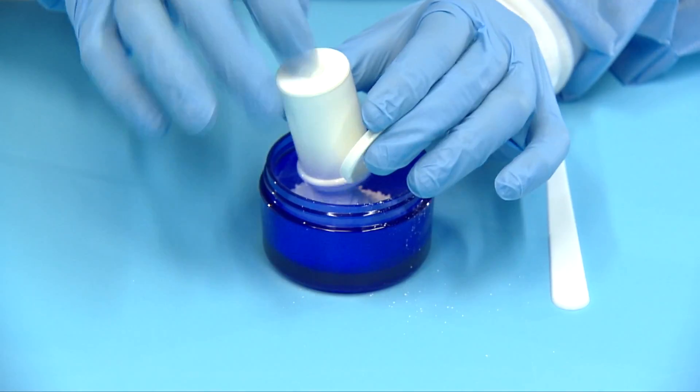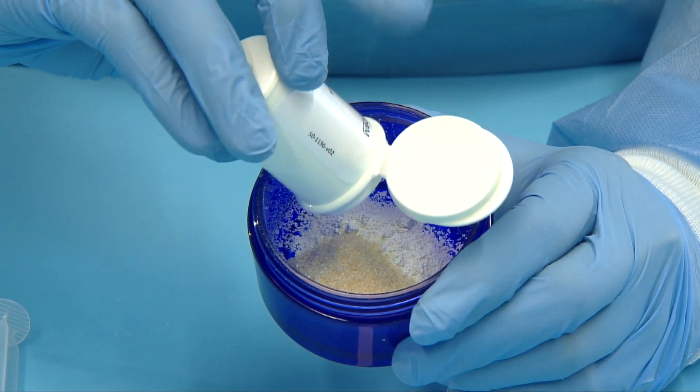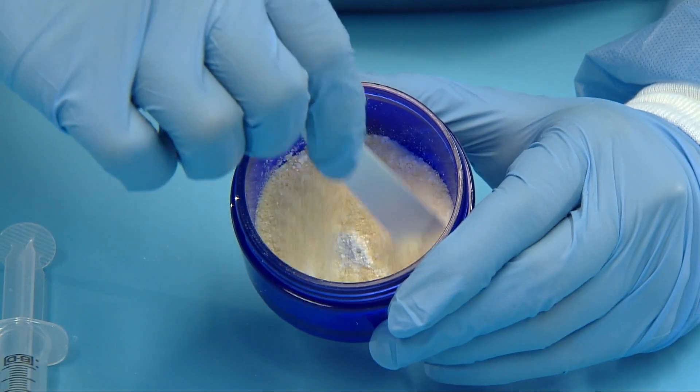Pour the calcium phosphate powder and DBM powder into the blue mixing jar. Stir dry powders to combine.